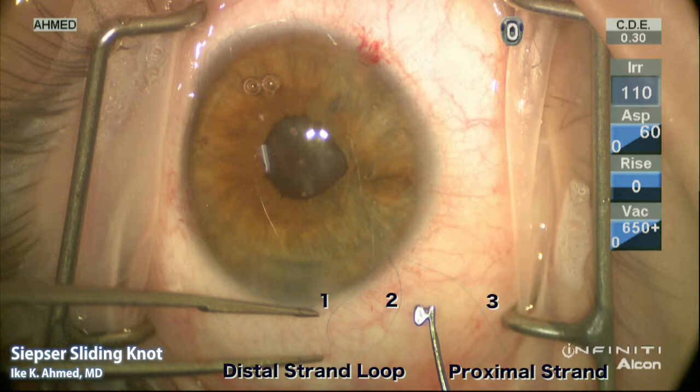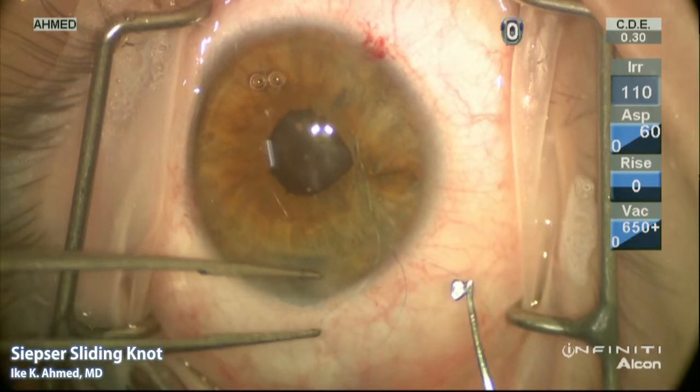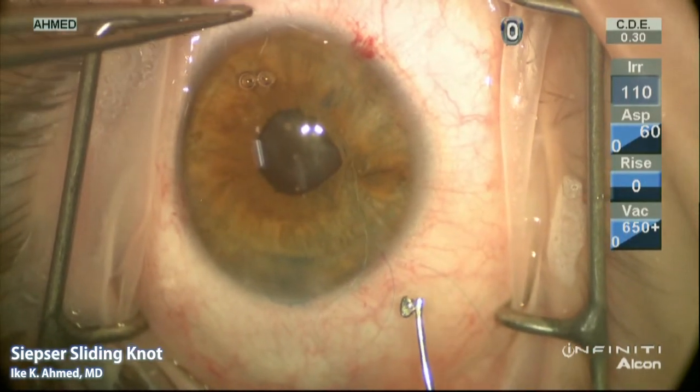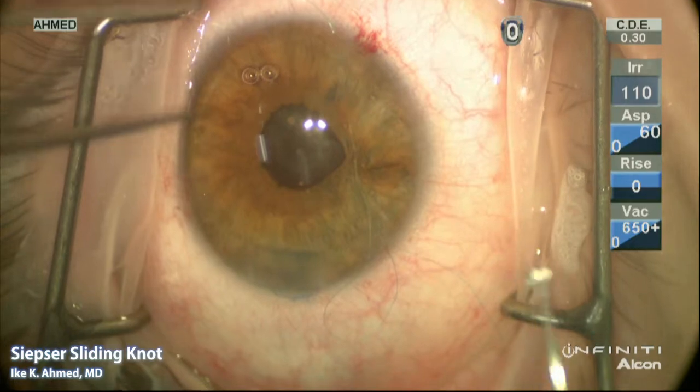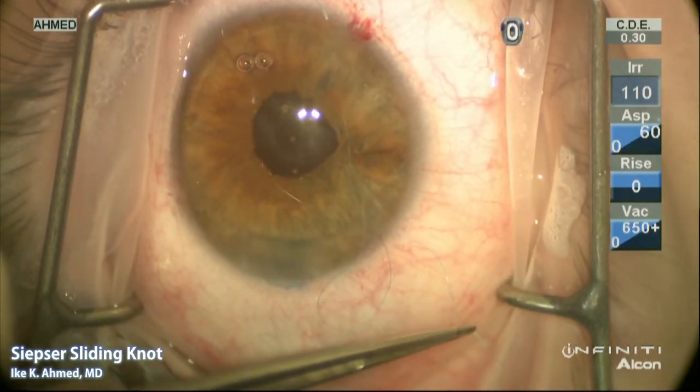It's important to have these three suture threads oriented correctly, as we'll show in subsequent steps. At this point the distal loop is identified. You can see the distal strand is pulled here to show the continuous nature of suture number one.